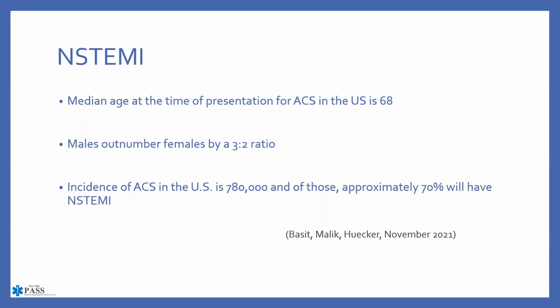We do the EKG only to find that there is a non-STEMI pattern. So there's no ST segment elevation there. We tell them, yeah, your EKG looks totally fine. So we send them home. Well, 70% of these patients that are having an acute coronary syndrome are in fact having an infarction pattern that we are missing not only in the pre-hospital world, but also in the emergency departments as well.